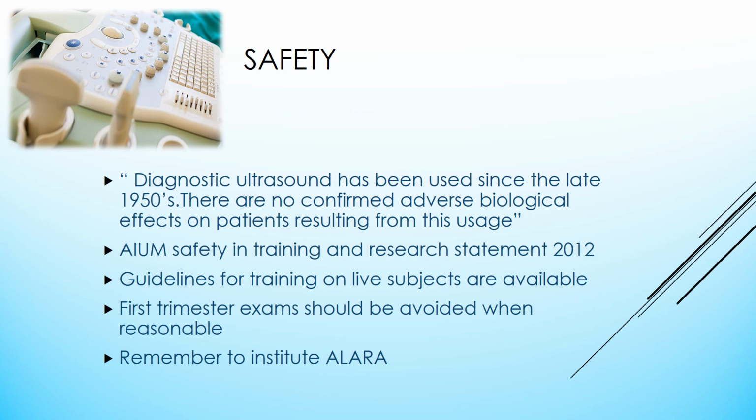Diagnostic ultrasound has been in use since the late 1950s. There are no confirmed adverse biological effects on patients resulting from this usage. There are AIUM safety and training and research statements from 2012. Guidelines for training on live subjects are available at AIUM. First trimester exams should be avoided when reasonable, and always remember to institute ALARA, or as low as reasonably achievable.